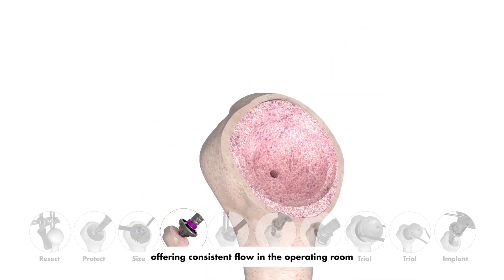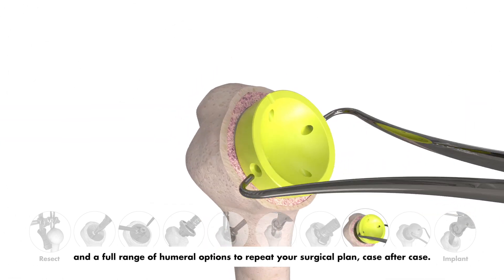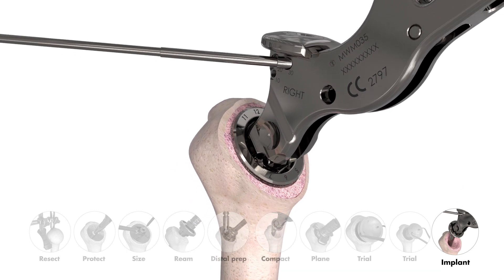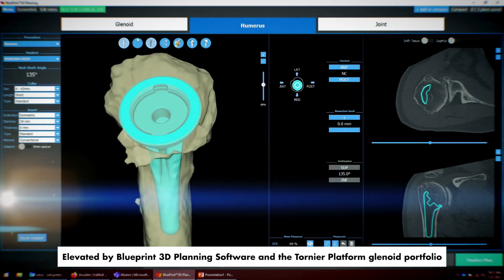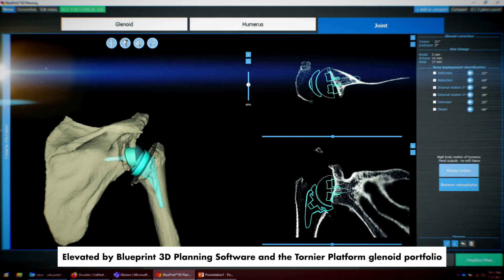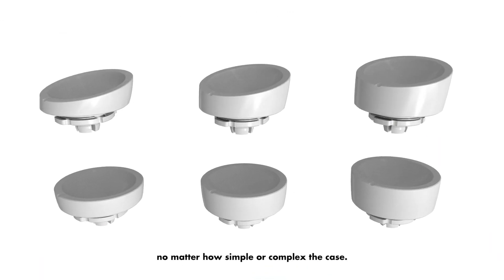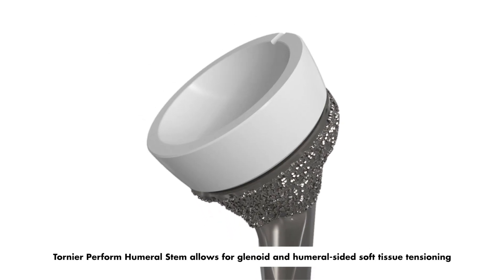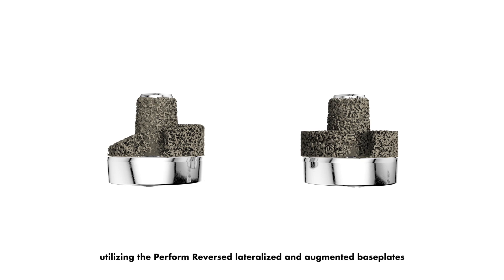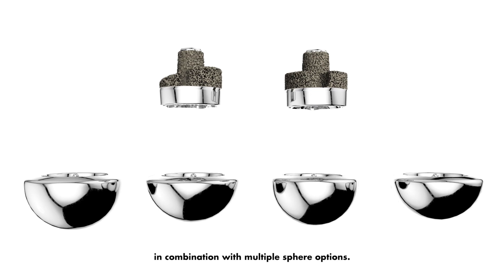Offering consistent flow in the operating room and a full range of humoral options to repeat your surgical plan case after case. Elevated by Blueprint 3D planning software and the Tornier platform glenoid portfolio, the Tornier Perform humoral stem provides clinical solutions no matter how simple or complex the case. It allows for glenoid and humoral sided soft tissue tensioning utilizing the Perform reversed, lateralized, and augmented base plates in combination with multiple sphere options.